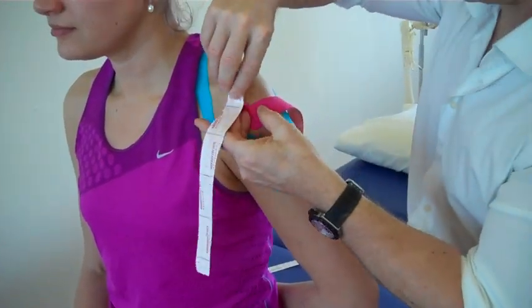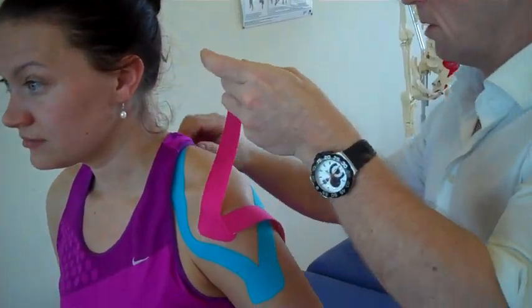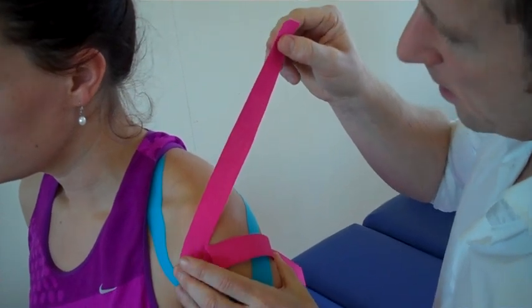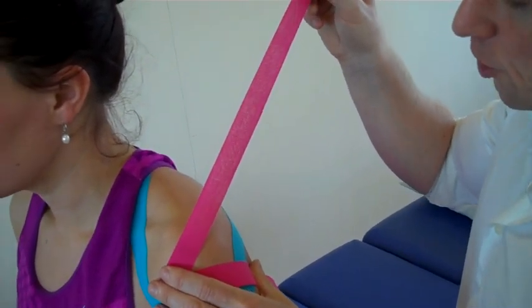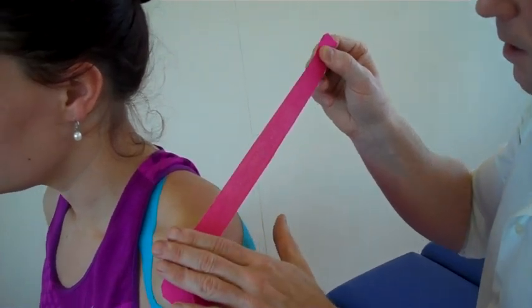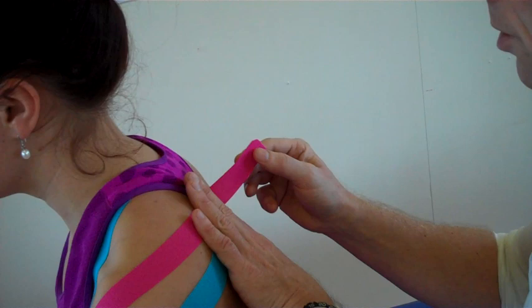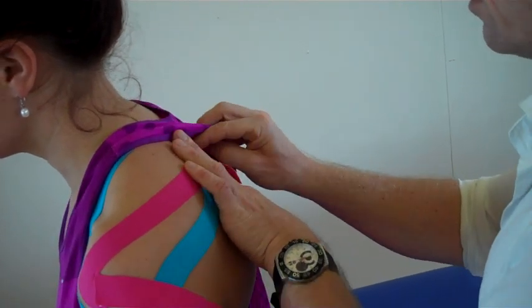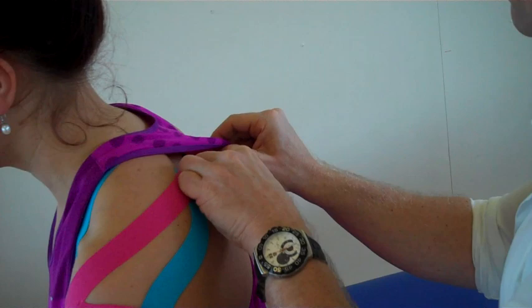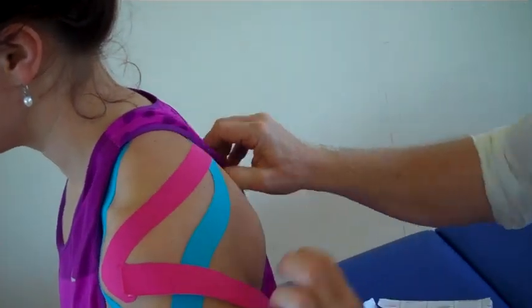Peel back one of the legs. No stretch on the end. Then bring your shoulder back a little bit — we've got 100% stretch, ease off a little bit to 80%. Find the spine of the scapula and literally just slightly above it where the supraspinatus will come round. Just feed this under and literally feed round. That's the first piece.